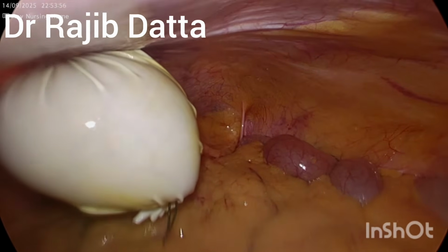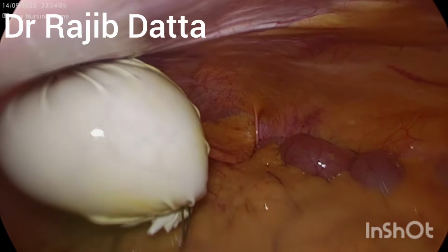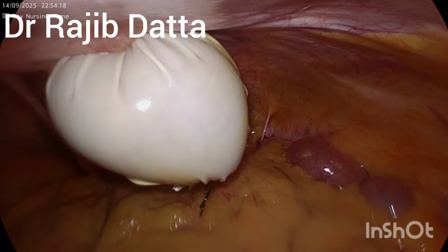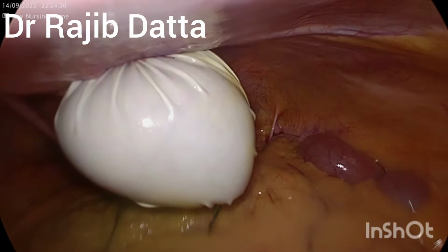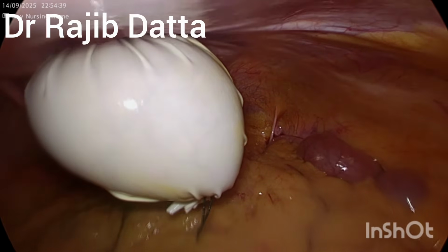The stones are getting stuck at the port site, so the tract has to be dilated. I am trying to crush those stones within this endo bag, but due to their hardness it is not properly achieved.